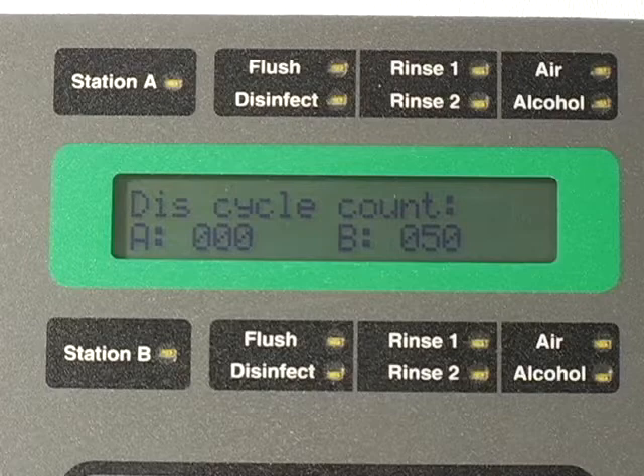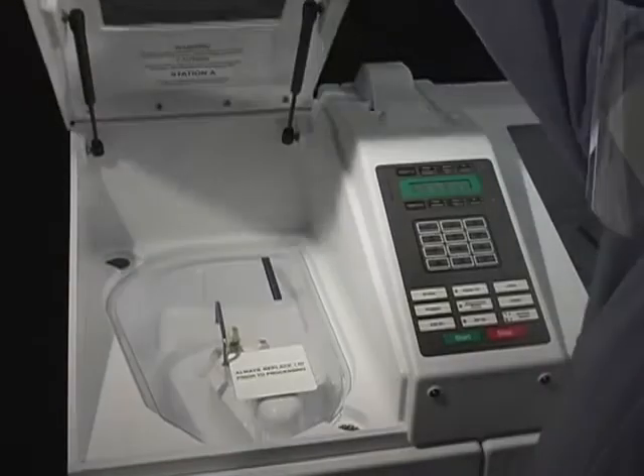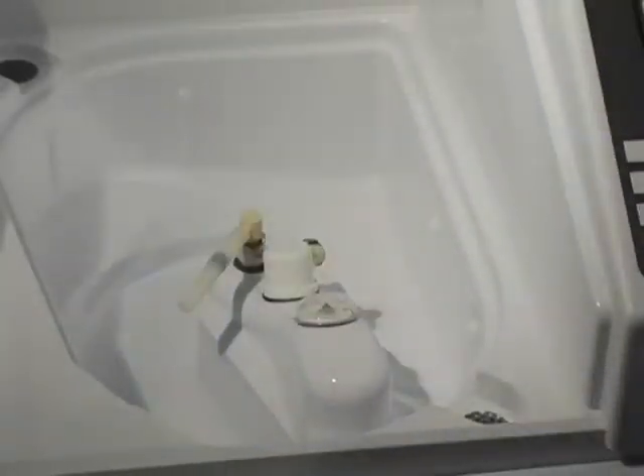When dumping heated disinfectant, do not manually turn off the disinfectant heater — it shuts off automatically when the disinfectant dump cycle is initiated, and the heater will turn back on automatically after fresh disinfectant is fully loaded. When the basin is finished draining, open the lid and remove the floating lid. Wipe the basin, strainer, and drain cover with a damp, lint-free cloth. Do not use paper towels. Replace the basin and strainer cover.